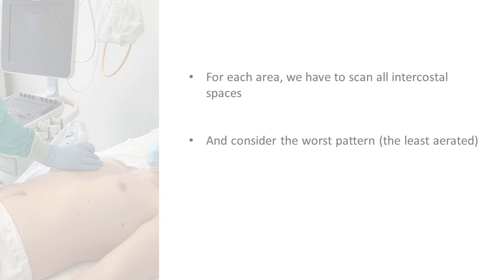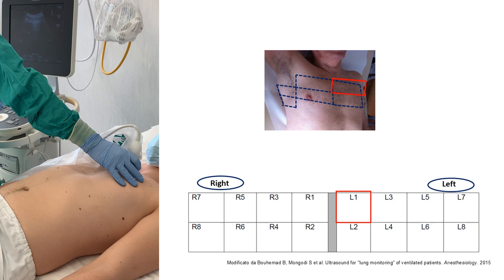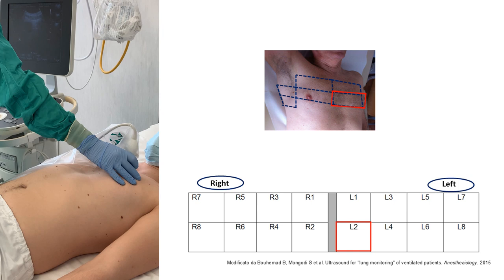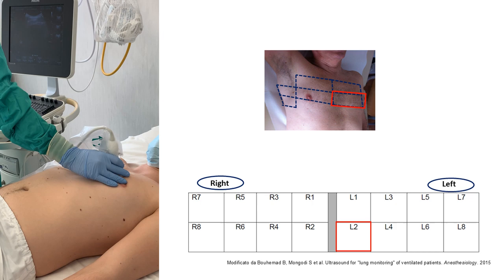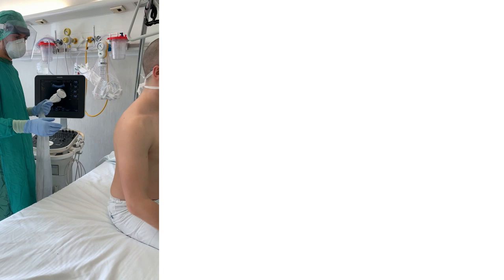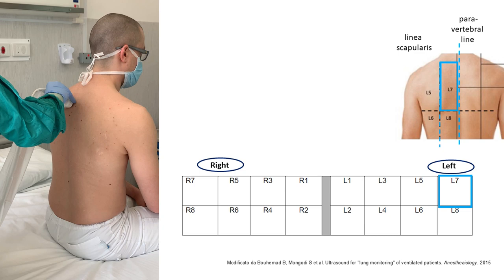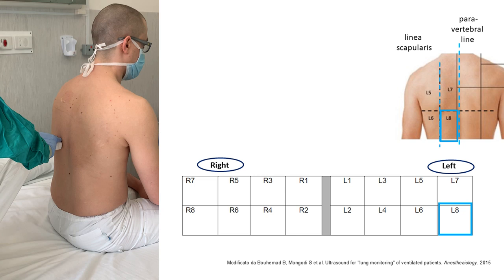Next we move to the left anterior thorax upper part, aiming to clearly visualize the lung sliding. We then move to the left anterior thorax lower part, although here we often find the heart. For the left lateral thorax, we do the same as for the right hemithorax. If the patient is able to sit, we can scan the posterior chest. Here we scan the left posterior thorax upper part, next the posterolateral upper part — where visualization of the lung is limited by the scapula — then the posterior lower part and posterolateral lower part.